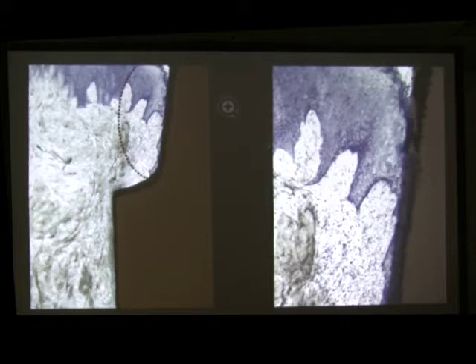So it's very rare, at least from the conversation that I had with the biologists that did these preparations. He told me that when doing histology with soft tissue, when you do the trephine, you will do mobility on the gum, and the gum will not be attached to the implant. So if you want to see attachment, I'm sorry, but probably you will not get to see what type of connection the implant has with the gum. And when he saw this histology, he was extremely surprised, because he did not receive specimens with this type of soft tissue connection to the implant.